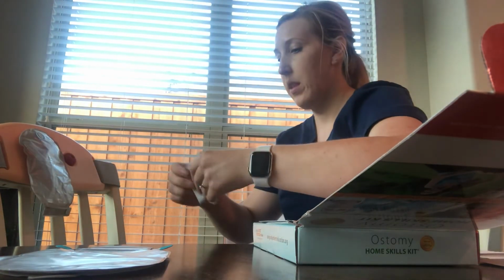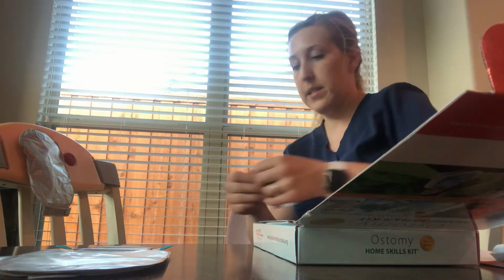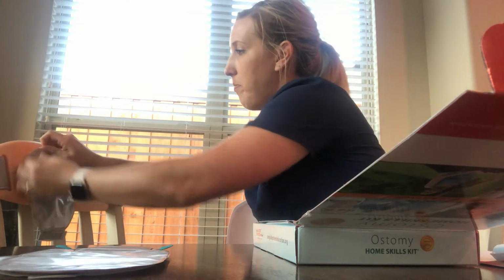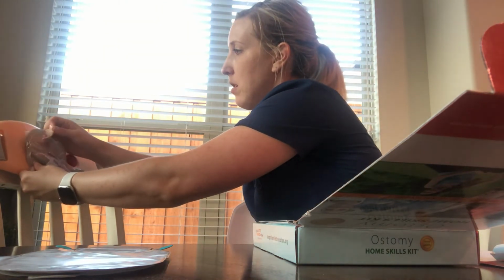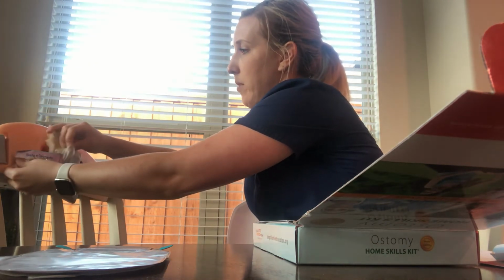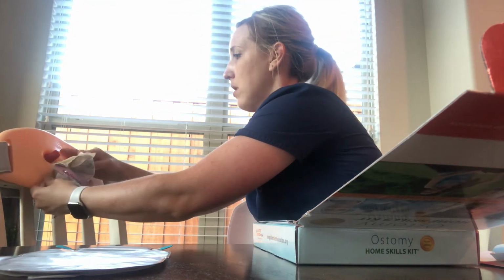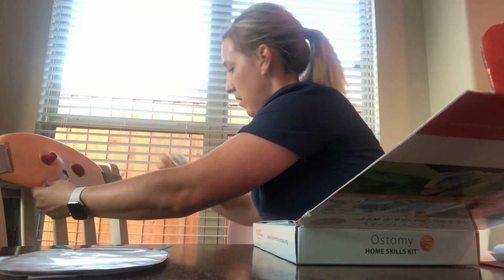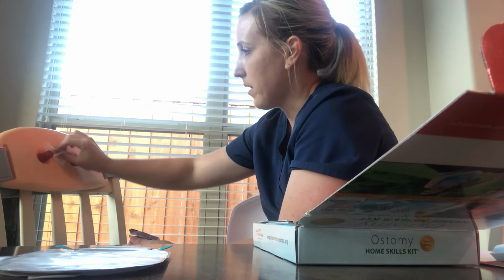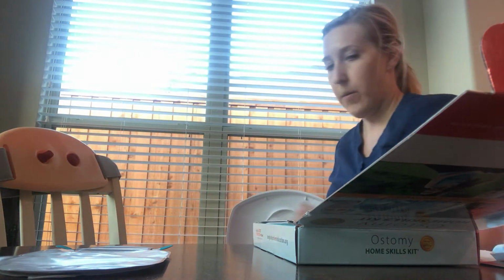Then you're going to take your cleanser, and several come in a little box, and you're going to open it, and you're going to pull the barrier off, and you're going to pull, and I usually pull down and over. And you can also use this to cleanse around. And then throw that away.